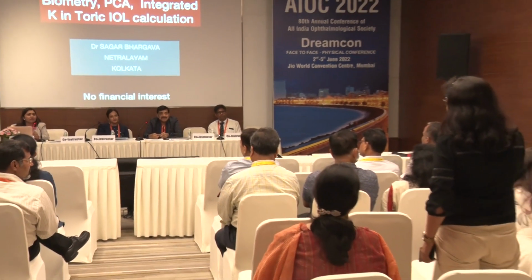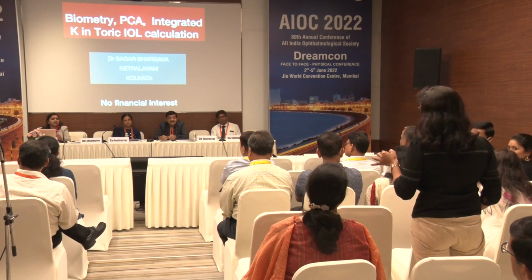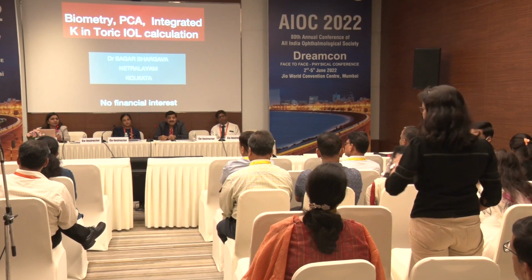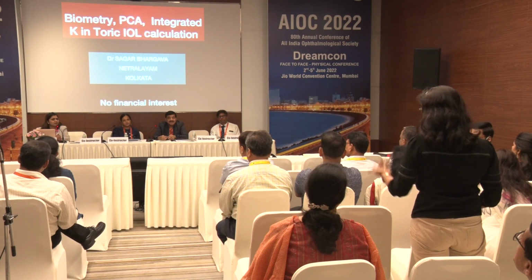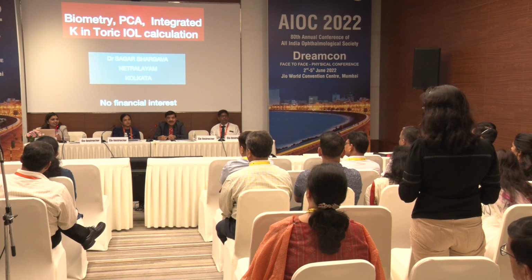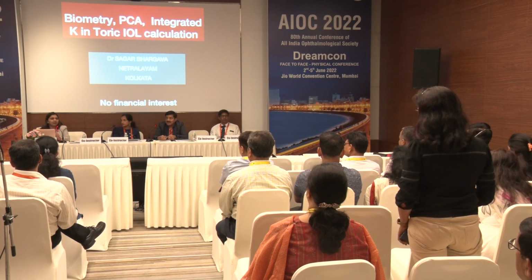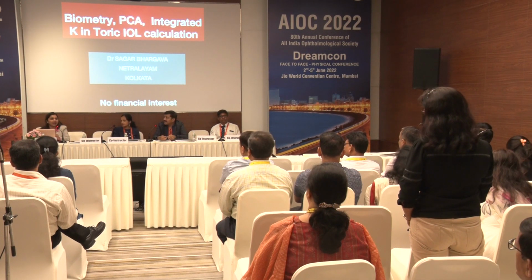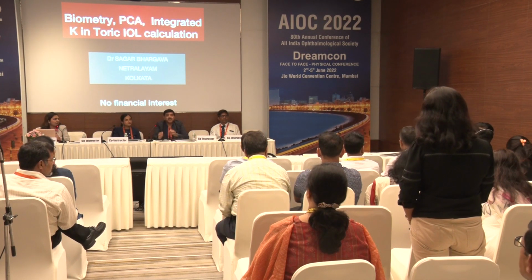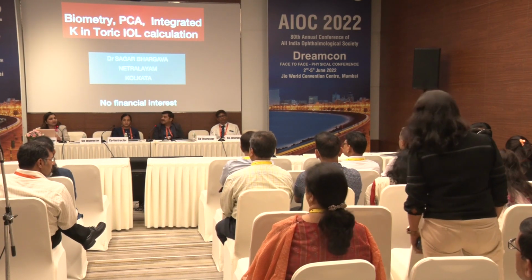Yes, a short question, please. One eye is normal, the other eye is post-operative. If surgically induced astigmatism of 1.5 is there after a scleral buckle, and previously it was normal, would you recommend a toric IOL? Yes, why not? After a scleral buckle, if the retina is stable and there is no other pathology, definitely give the patient the best vision you can at that point of time. The buckle will stay there, you are not going to remove it, so the astigmatism will persist. So it is better to implant a toric IOL.